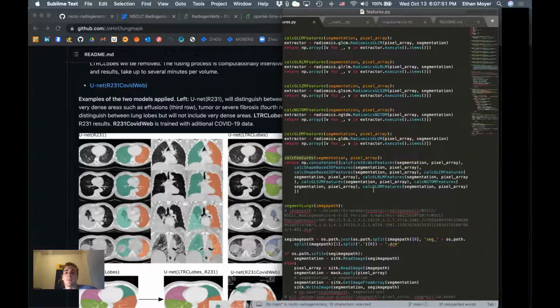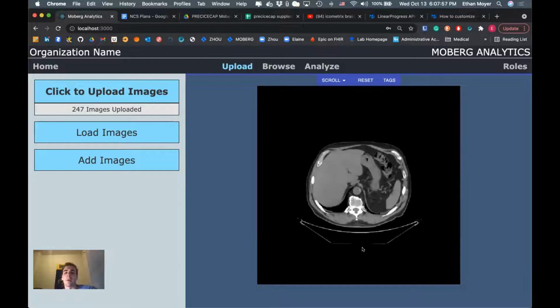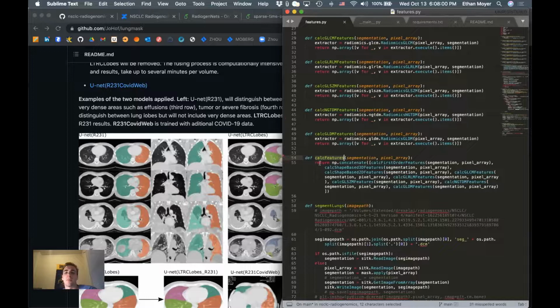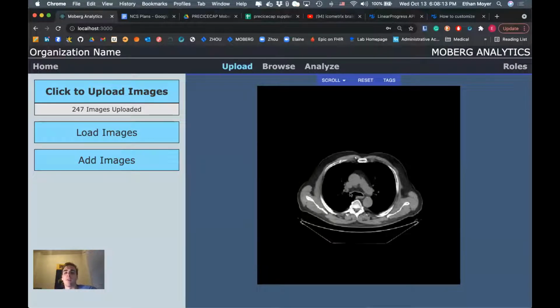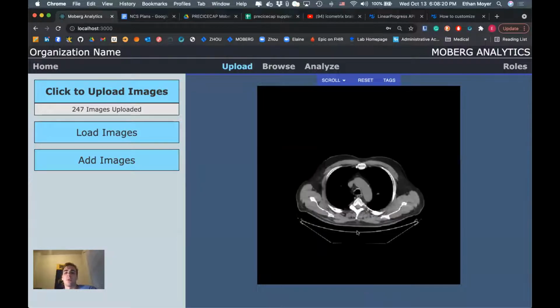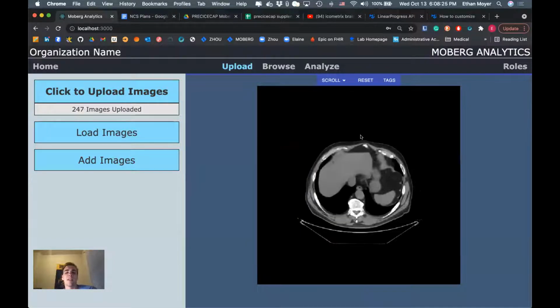The problem is that, you know, there's another dimension to this. I'm scrolling in here, and we basically want a set of features per each patient, right? We want 161 features, or however many there are here, for each patient. So we have to somehow average across relevant slices. I don't know how we want to do it. We could average across the entire lung volume, or we could just pick the most representative lung slice.